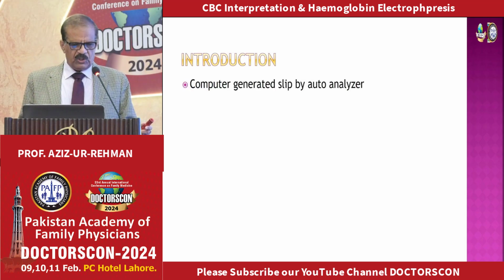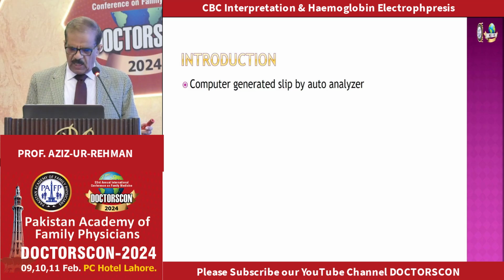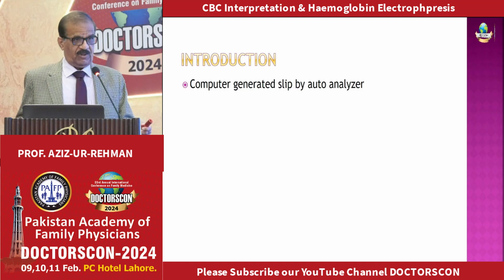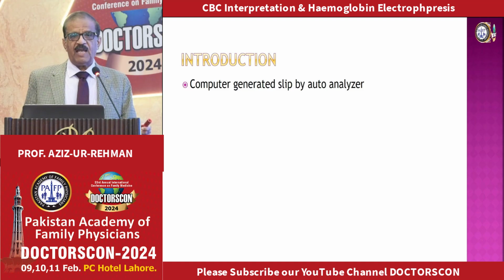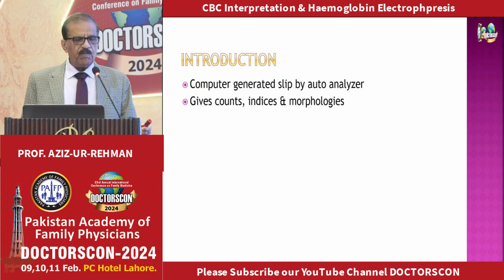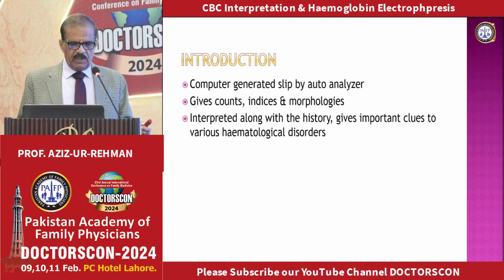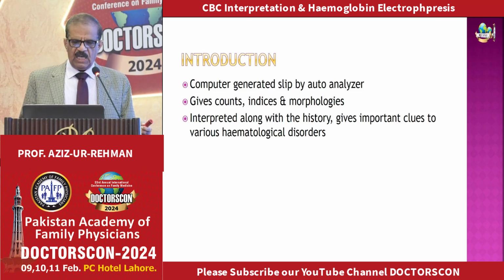What is this CBC? It's a computer-generated slip by auto-analyzers. These days, everything is getting automated. That makes the machine very efficient and very reliable actually, because humans are many times source of error. So machine is very accurate when it comes to counting, measuring. I think it's very important, and it should be interpreted along with the history. It gives very important clues to the various hematological disorders.